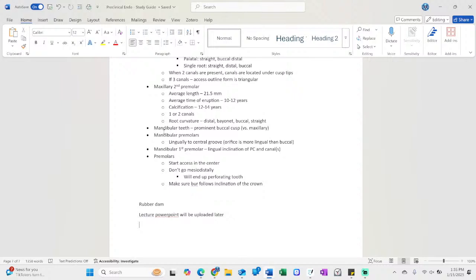It's also best to ignore the template holes on the teeth. Instead, you're going to punch your holes into the quadrant that you're in. The template is a little bit too specific, and you don't need that to be successful. You can switch this up, though. Like I mentioned, there's no recipe book. I had a patient with COPD and asthma and all these issues, and sleep apnea, and he couldn't breathe really well. So we were working on number 2, but I ended up punching over here, and the whole dam shifted over, so that he had, as Dr. Lily mentioned, that area to breathe.